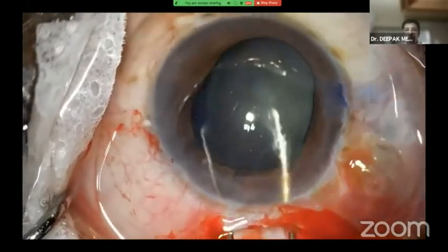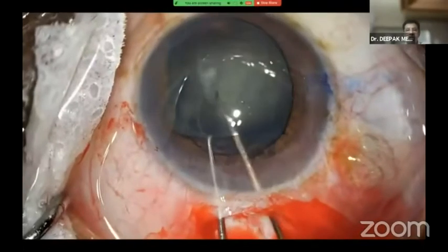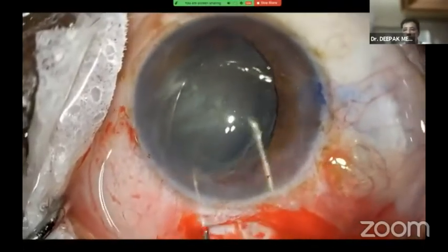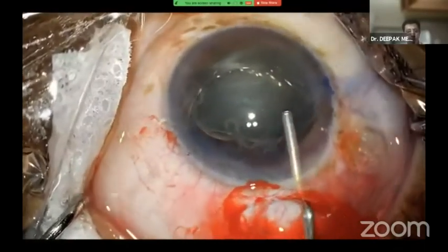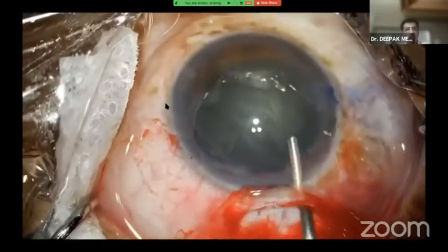I think this was my tip for the beginner. These are softer nuclei that are very easy to prolapse out. So once you have achieved this, you can then graduate to bigger, harder nuclei. With that, I would like to conclude my presentation.